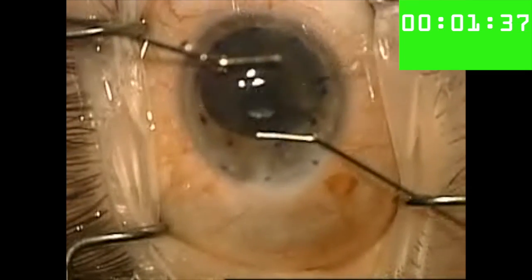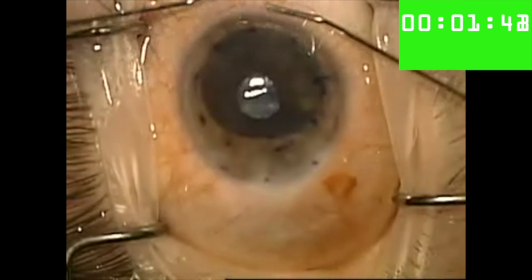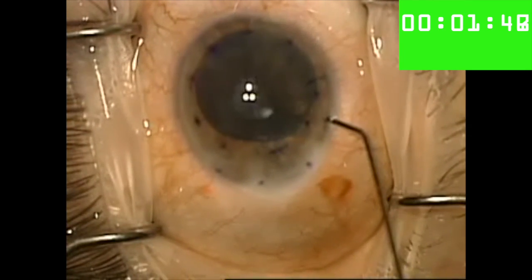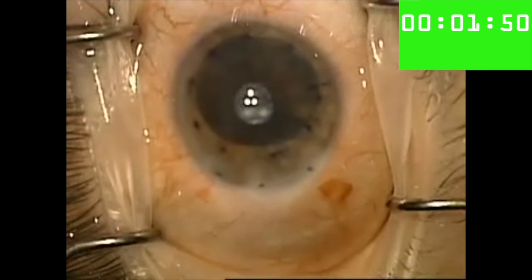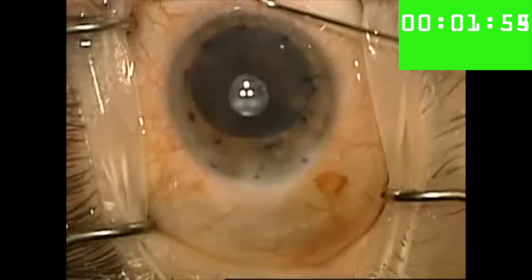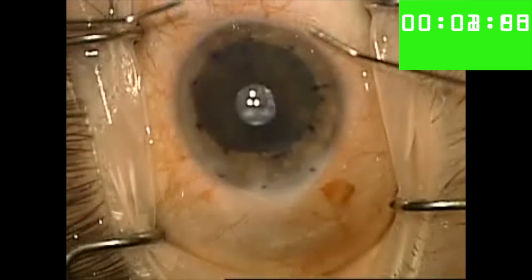A quick tap on the lower part of the graft there and the graft is completely open. I then begin to center the graft inside my marks using a cha-cha shuffling technique. A couple of golf strokes to the limbus but neither of them are working, so I then very gently inflate the chamber very slightly so that there's a little bit more space for the graft to move. I then try the same techniques — first the cha-cha shuffling technique, then a few golf strokes to the limbus, and finally the cha-cha shuffling technique, which is what moves the graft into the marks.